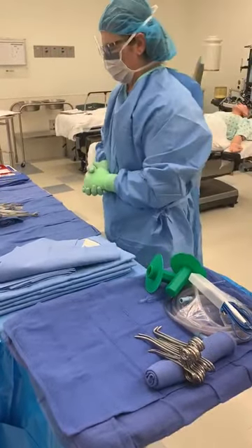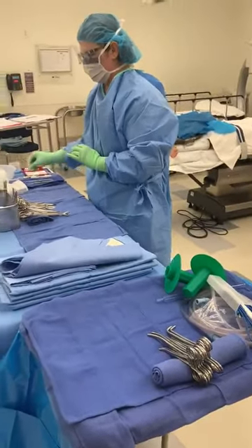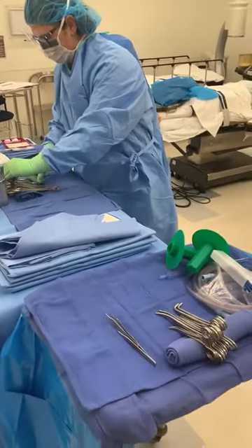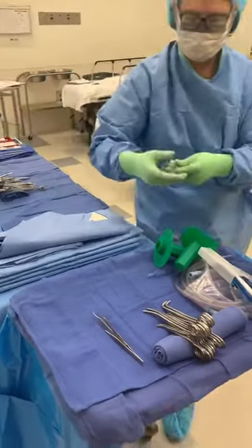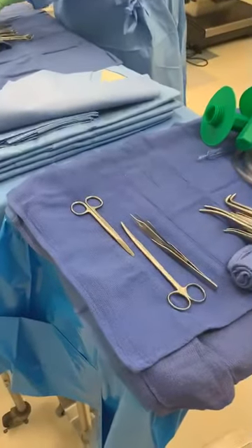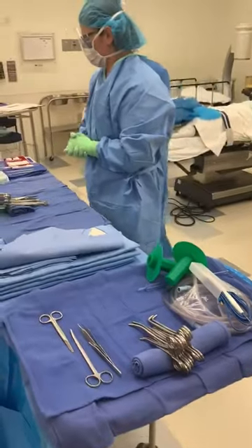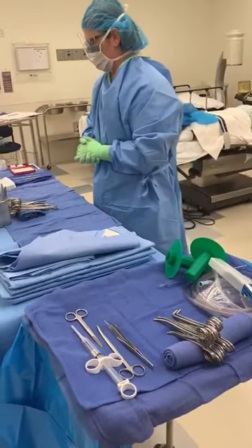Place the following items in order next to your towel roll, handles towards the surgeon: forceps, scissors. For your scissors, it's always good to have that straight mayo and that Metzenbaum — those are really going to be your two most common used scissors. You also need your syringe with a needle attached and the scalpel.